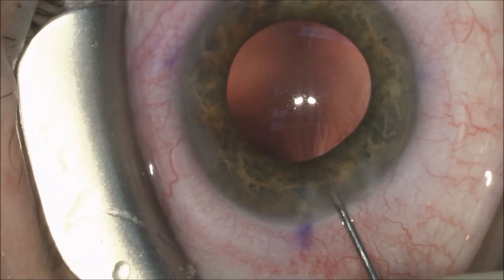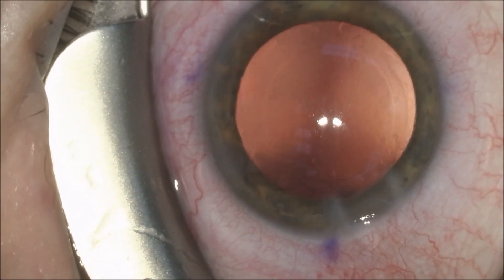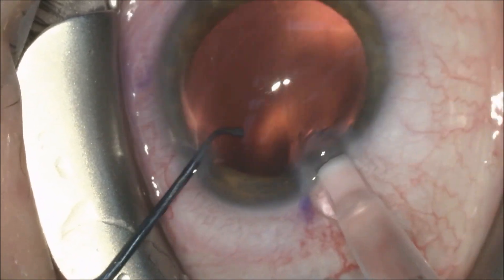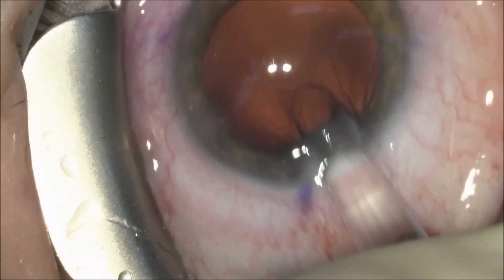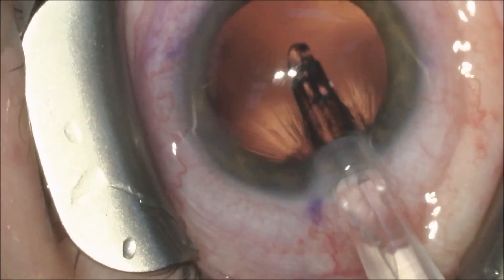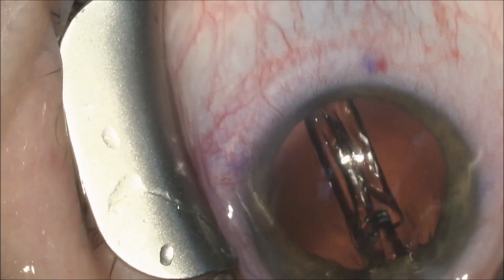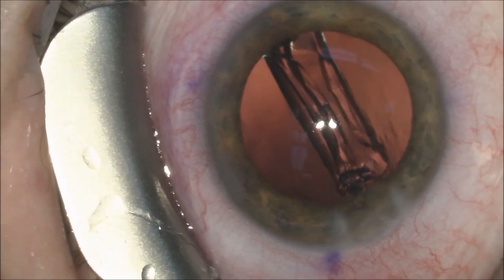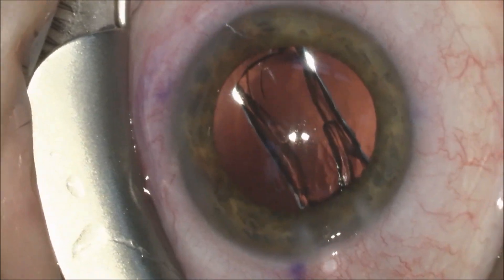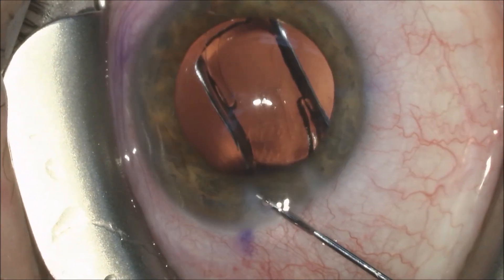Once this has been completed, we will inject a cohesive viscoelastic — in this case AMVISC. You can see a beautifully round 5.2 millimeter capsulorrhexis, which is really not easy to achieve manually. I've done over 25,000 cataracts and still find that the laser is able to center a capsulorrhexis better than we can do manually.